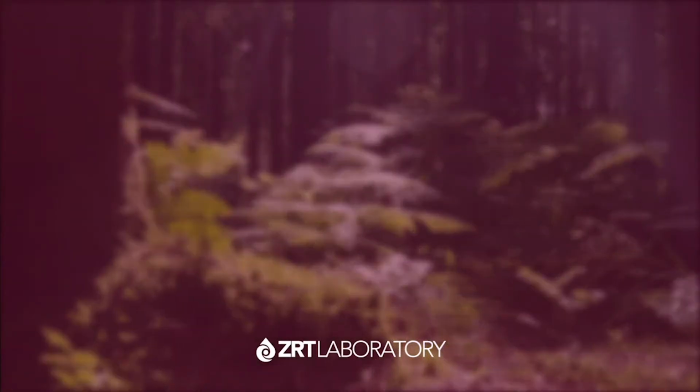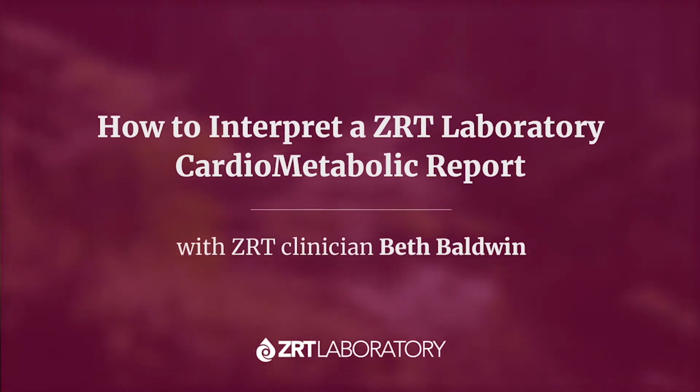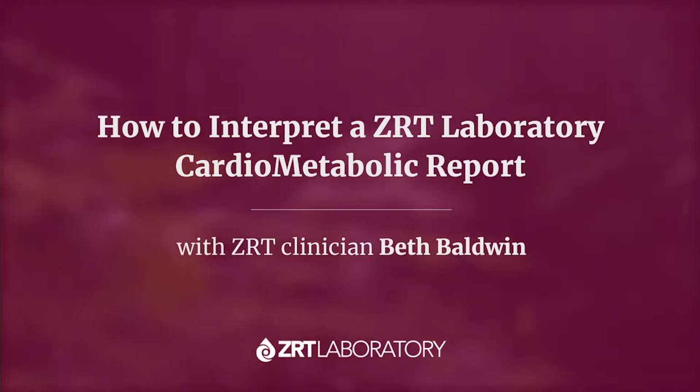Hi, this is Dr. Beth Baldwin, and today I'll be walking you through how I interpret ZRT Laboratories' cardiometabolic profile.